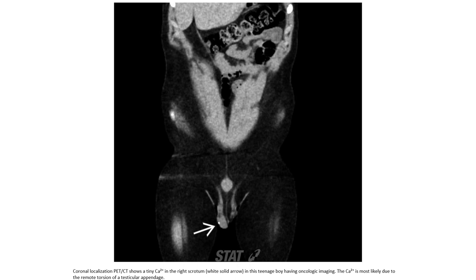PET CT scan shows a tiny calcification in the right scrotum in a teenage boy with an oncological history. This calcification is most likely due to remote torsion of a testicular appendage.